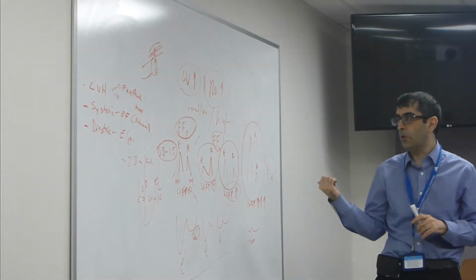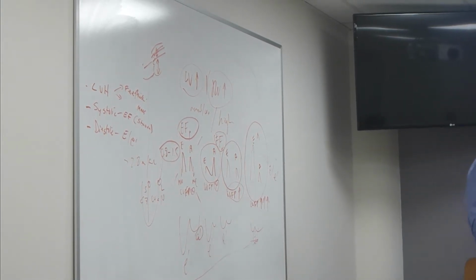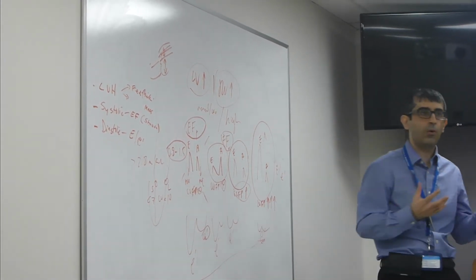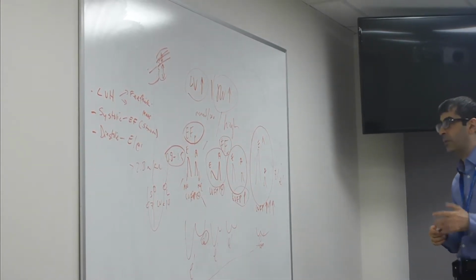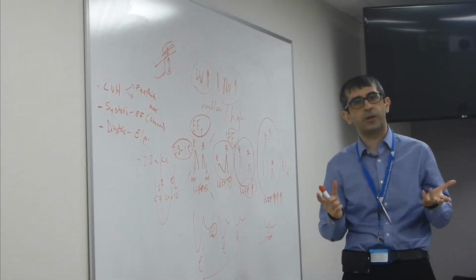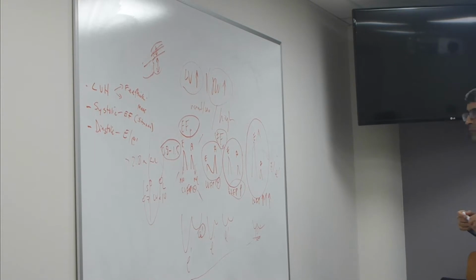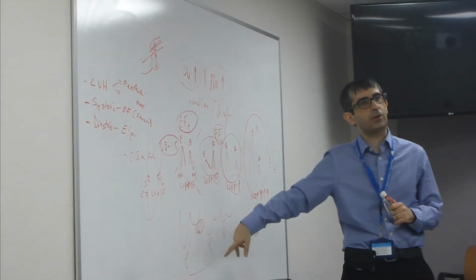Another thing is all kinds of prosthetic valves. When you manipulate the heart, especially if you have mitral repair, mitral prosthesis, even aortic prosthesis, because they open the pericardium, this whole thing is not as validated as in a native heart. Then elderly people with significant mitral annular calcification, right? You see there's a lot of calcium in the valve, a lot of calcium in the annulus. Your recoil goes down, but it doesn't mean that you have diastolic dysfunction.